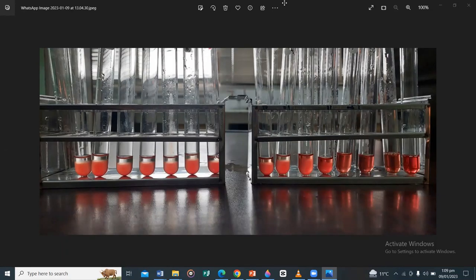This is going to be our end result after one hour. The first test tube labelled S and the next series of test tubes will show sedimentation of blood with clear supernatant fluid on top. Finally there is going to be a pink tinge — this is when hemolysis has started. And eventually, as you can see, in this test tube hemolysis has completed, because now the colour of the fluid is uniform red. So your osmotic fragility range will be from where the pink tinge begins — indicating both sedimentation and hemolysis — to where hemolysis is completed.